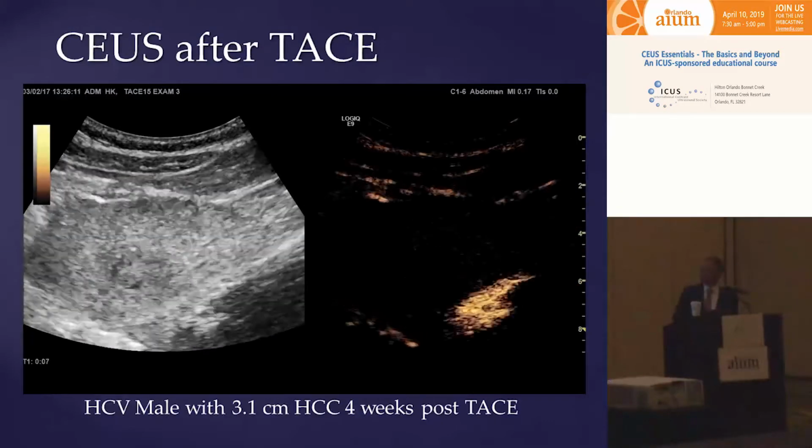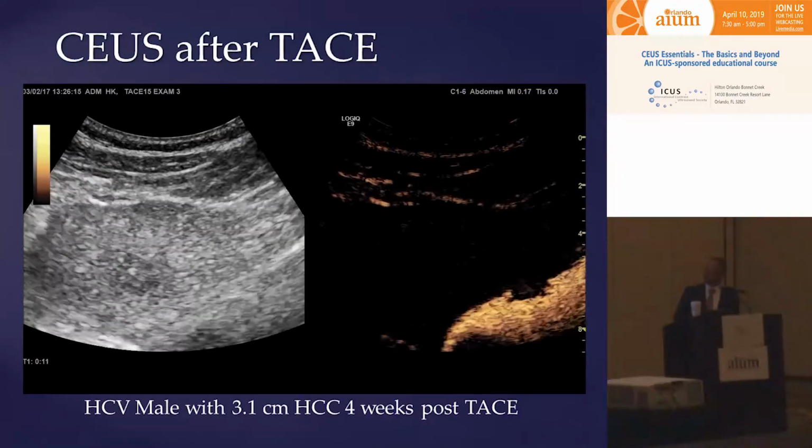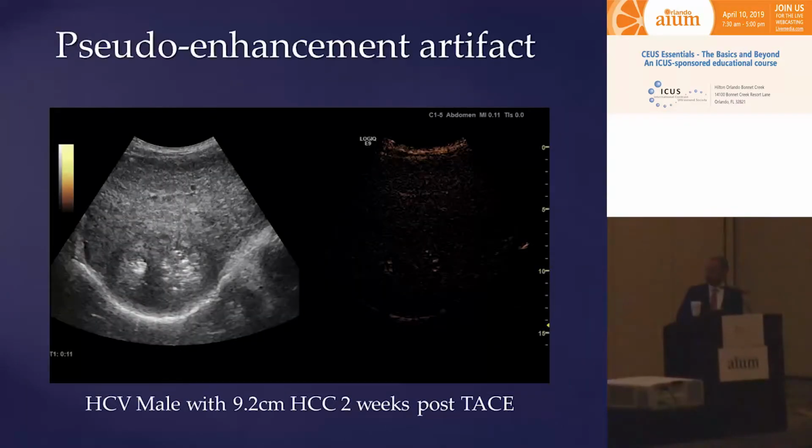Let's see if it plays. Yeah. You can see this lesion, and then we inject contrast agent. There is absolutely nothing inside of this lesion, confirming complete ablation of this mass. The problem happens when we see lesions like this.